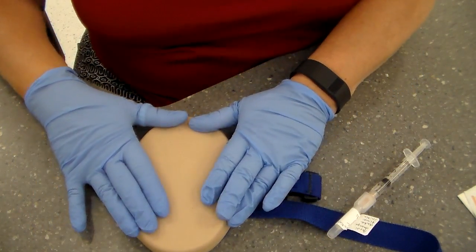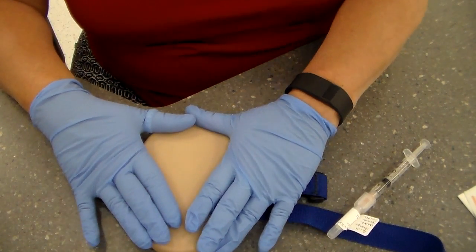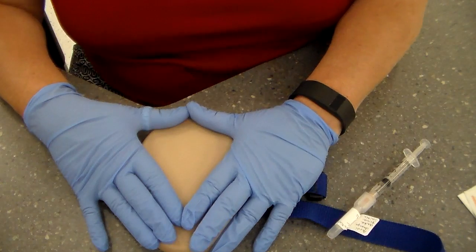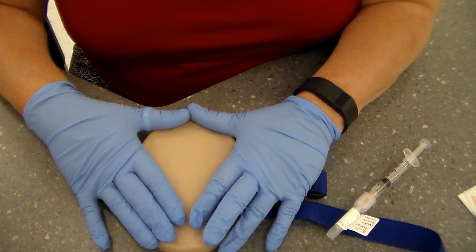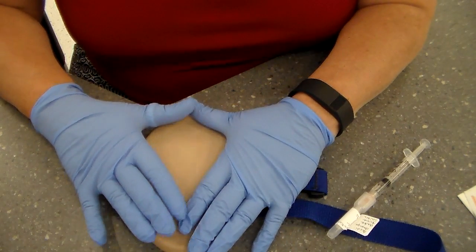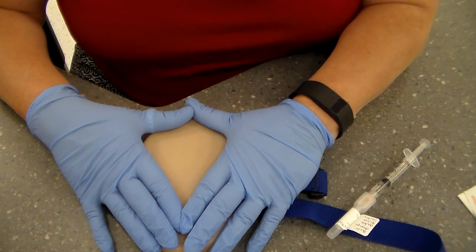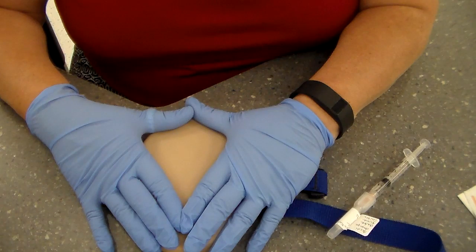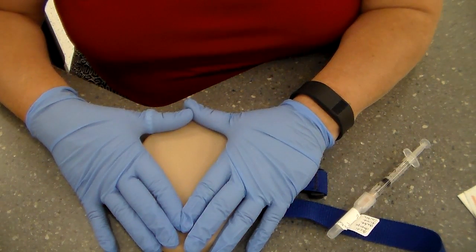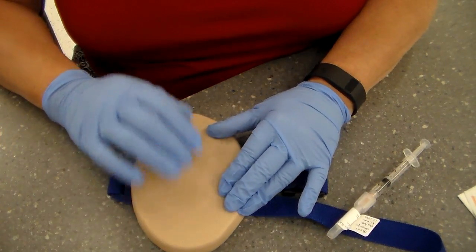And this is my patient's site for the subcutaneous injection. Again, if you need to know where those sites are, look on Blackboard because I posted something for you. You can also look in your Pearson textbooks and your skill books. I forget the pages, but they will show you exactly where subcutaneous injection sites are. Okay, so this is going to be our site.